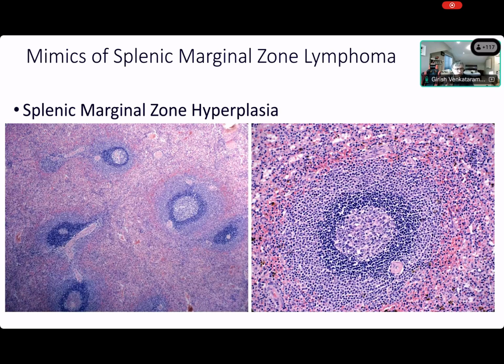Sometimes you will see a normal spleen come out in a trauma case, right? They will just remove the spleen in a gunshot wound or whatever it is, and they will send you the spleen for examination. And you will see this kind of prominent marginal zone sometimes, and you should not jump to the conclusion that this is lymphoma, right? The weight is normal, and you just see some expanded marginal zones, leave it as hyperplasia. Don't jump to lymphoma there. You don't need to flow the spleen and try to get to a diagnosis either, right?